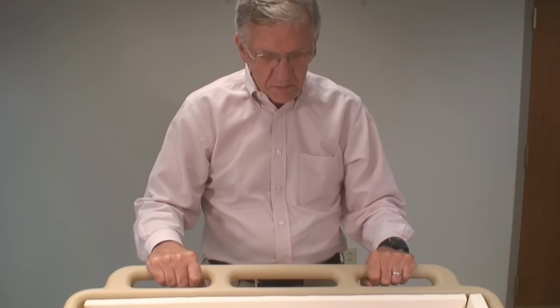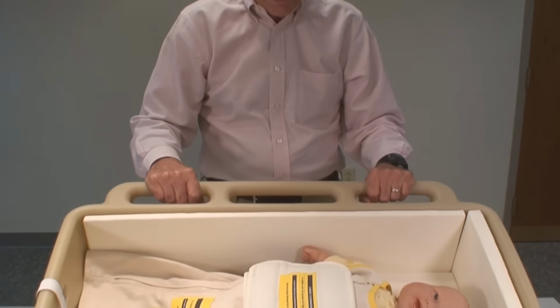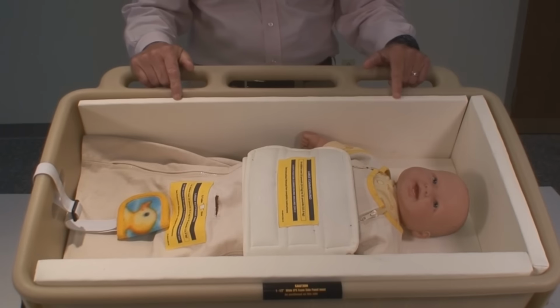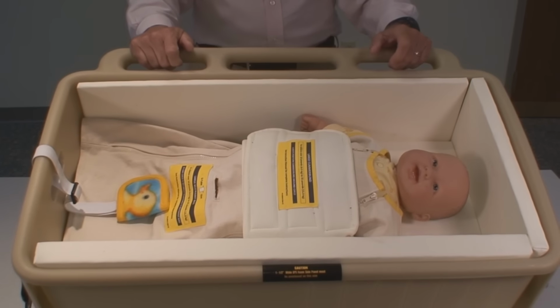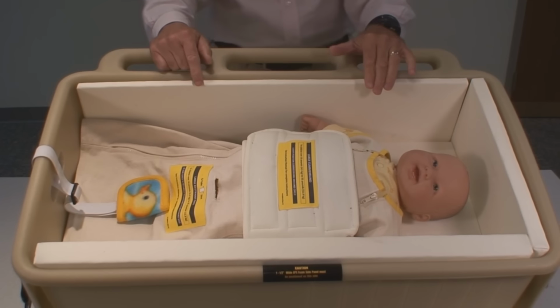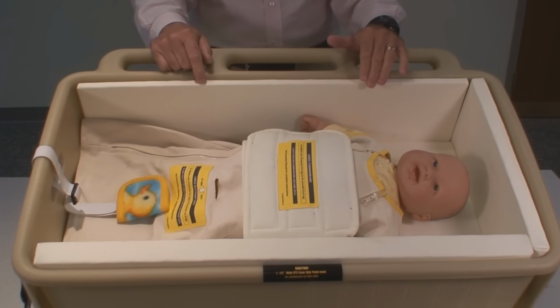This is the Hope car bed, and what we're going to do is talk a little bit about the features, and then show you how to change out the various components. The bed comes with two size restraint bags. There's a small bag that goes from 4.5 pounds to 10 pounds, and a large restraint bag that goes from 10 pounds up to 35 pounds.